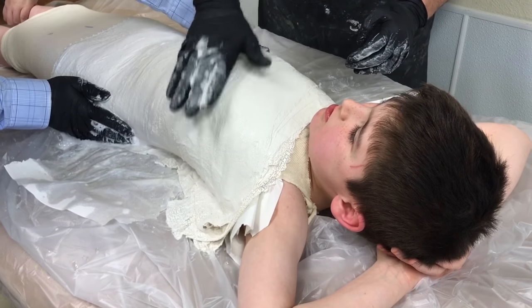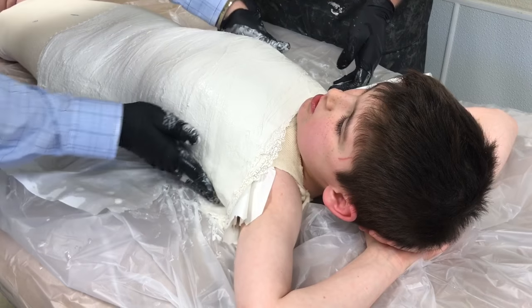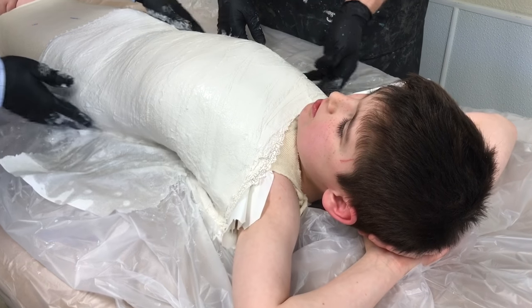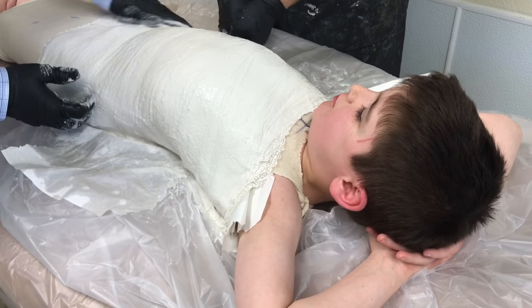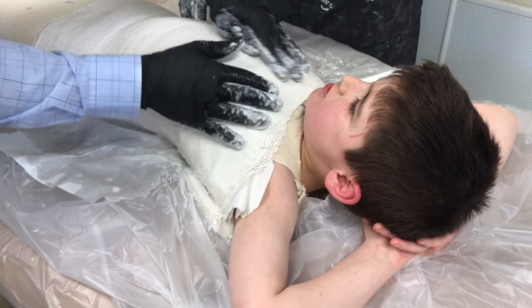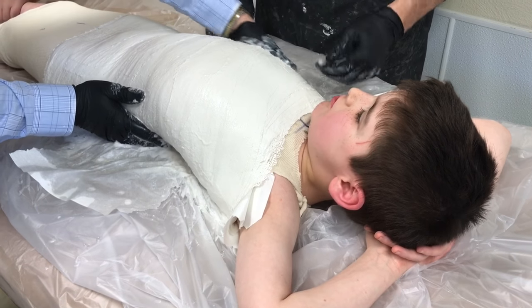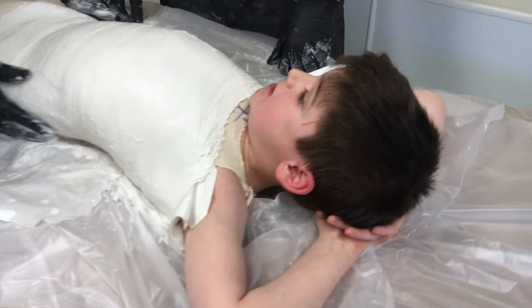When it's hard like a turtle shell it'll feel warm. It's okay, honey. The good news is you're not taking this one home with you. Right now it's as tight as it's going to be until we start pushing a little bit. Don't make it tight!